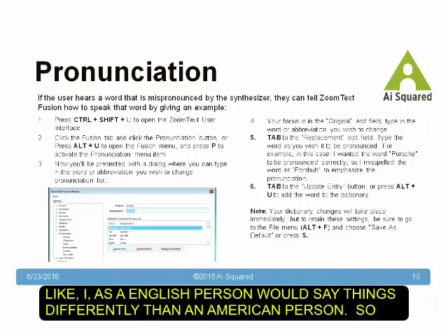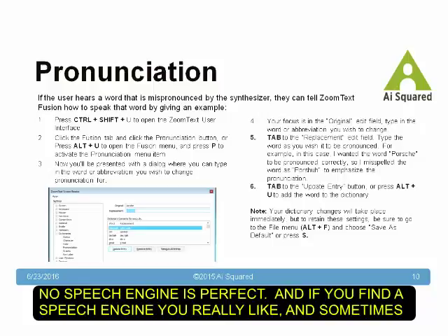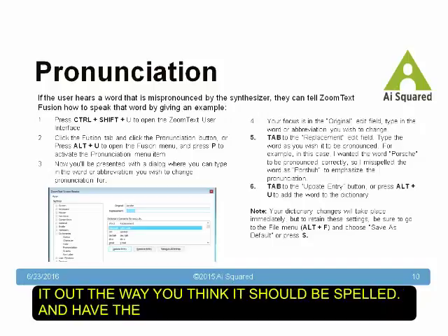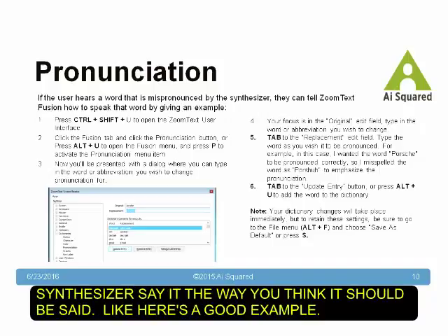Like I, as an English person, will say certain words differently from an American person. So no speech engine is perfect. And if you find a speech engine you really like, for most of the time, but some words it says wrong, you can actually make it say the word correctly. Effectively what you do is you spell out the way you think it should be spelt to make the speech synthesizer say it the way you want it to be said.